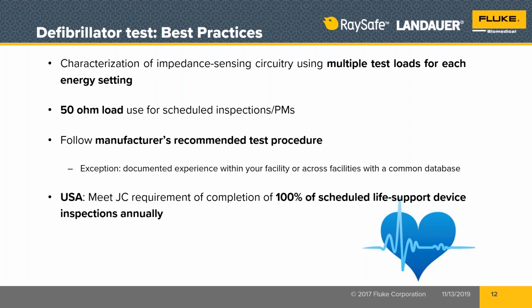You need to know a little bit more about the incident that occurred that they were complaining about. So what I have done is I have asked the doctor or the nurse, okay, give me a little better idea about what I should think the impedance of this patient was. So their body mass. What would you say their body mass was? Big, small, kind of what? And that gives me a sense of where to do my testing.